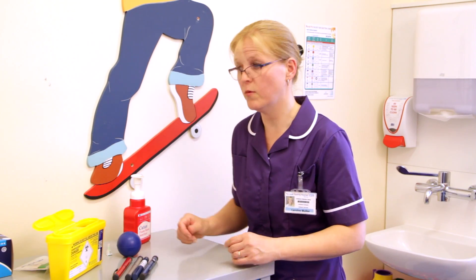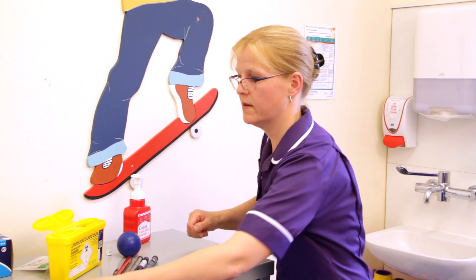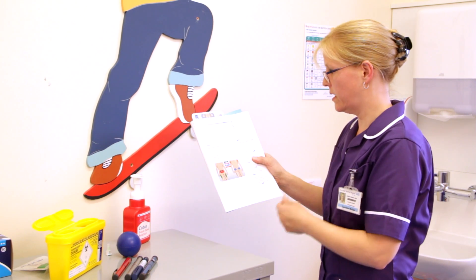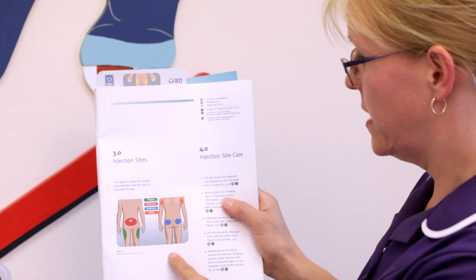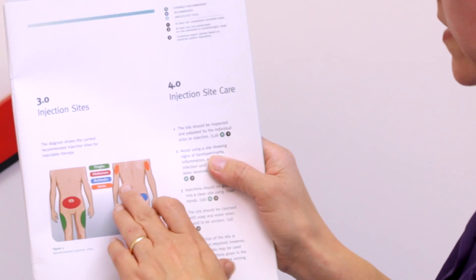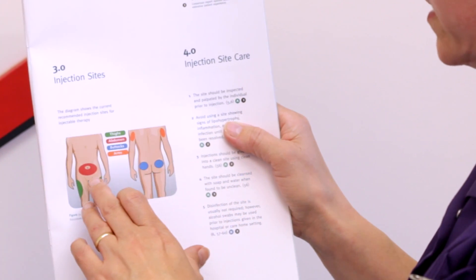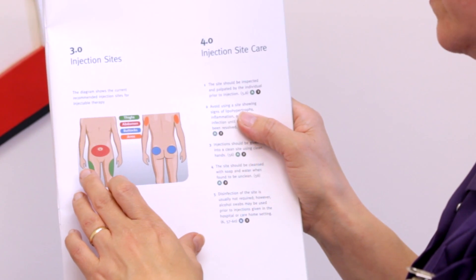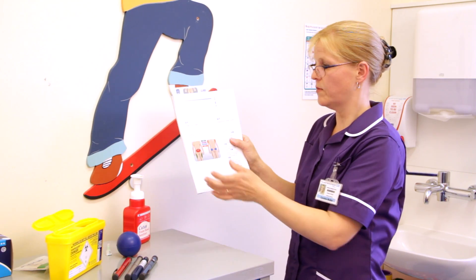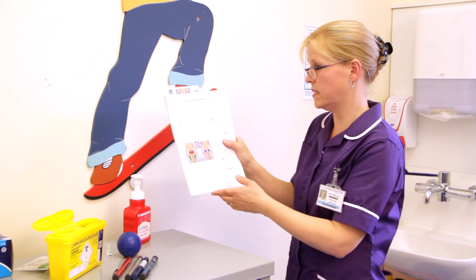Now I'll show you whereabouts you can do injections. This diagram gives some examples of the different injection sites. You can see that there are arms, buttocks, abdomen, and thighs. The most appropriate site depends on the age of your child, so it's important to discuss this with your diabetes nurse.